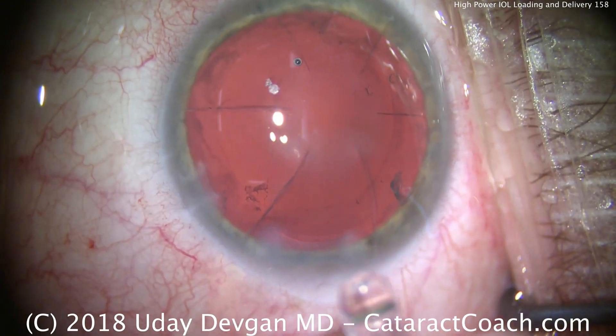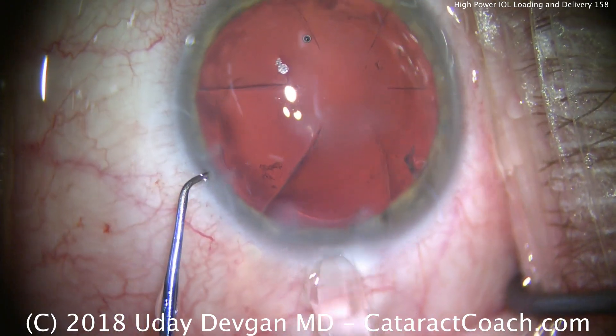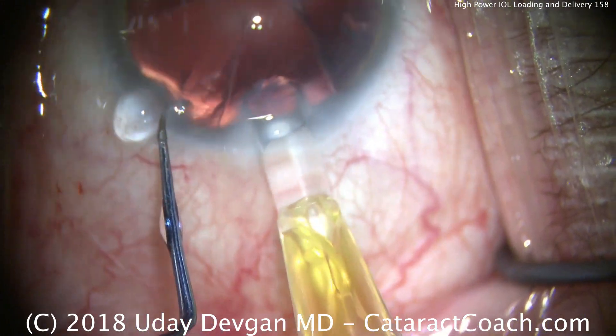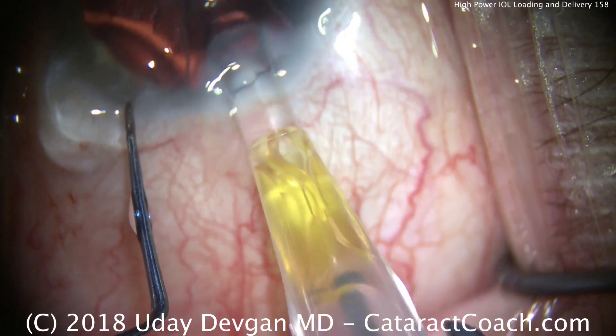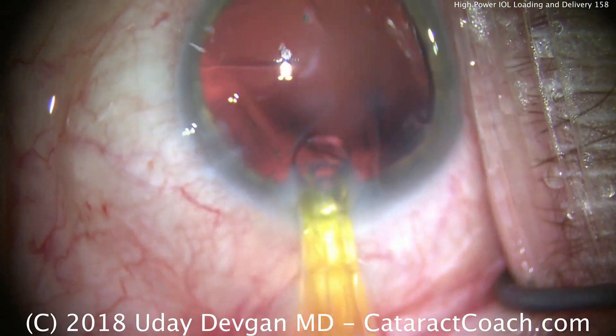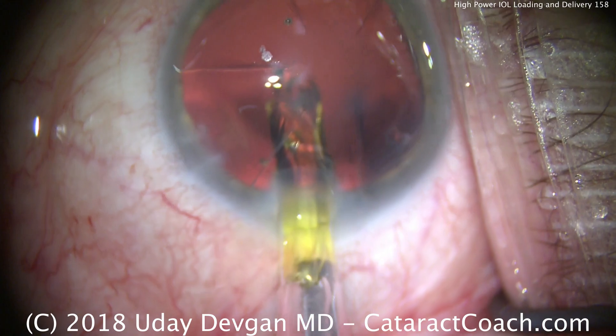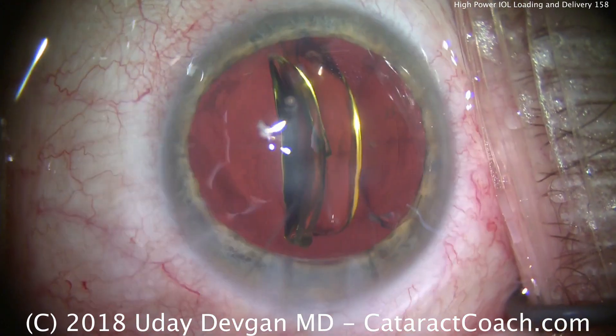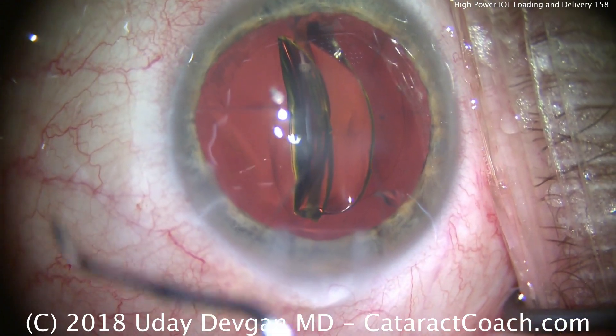Welcome to CataractCoach.com. Today we're talking about high power IOLs. This is a 30 diopter lens going into an eye — it's tough to get in there. Using the chopper to fixate the eye, the cartridge is bigger in this situation; it's not the standard smaller cartridge tip. Therefore we need either a slightly larger incision or a wound assist technique.